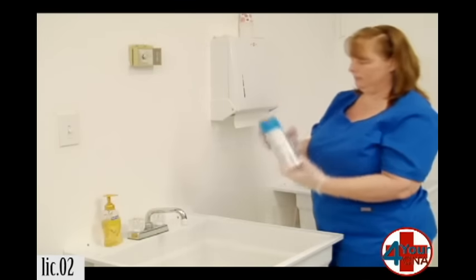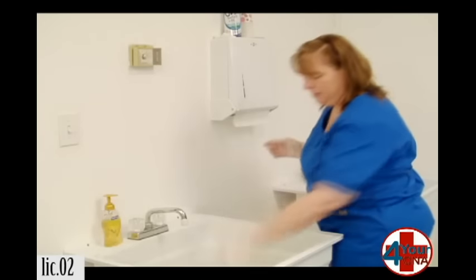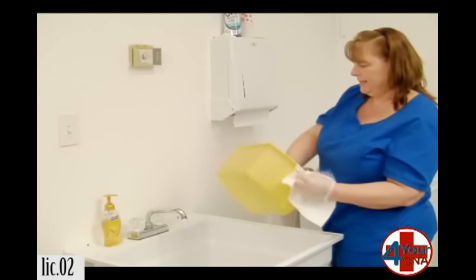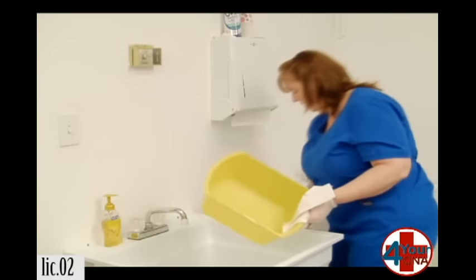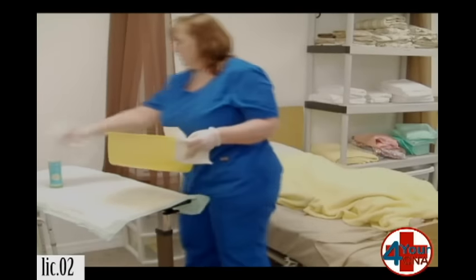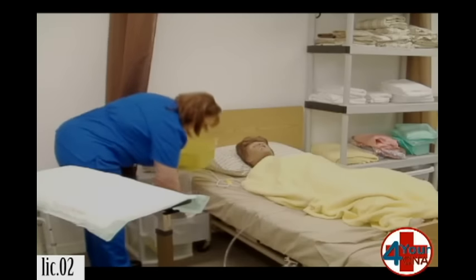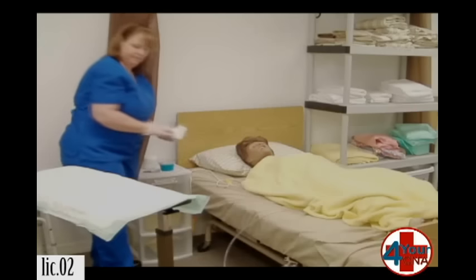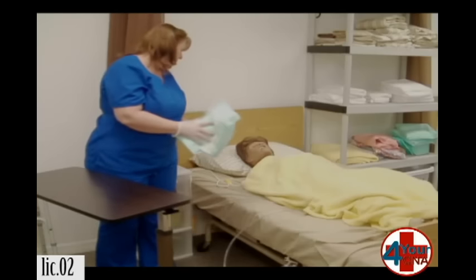We're going to set it down and spray it with disinfectant spray. Paper towel to pick it up. Paper towel to dry the inside. Throw that away. Paper towel to dry the outside. Throw that away. And one for the drawer. Ms. Jones, I'm going to pick up your soap and put your basin back in your drawer. These items will get thrown away. And I'm going to go remove my gloves. I'll be right back.